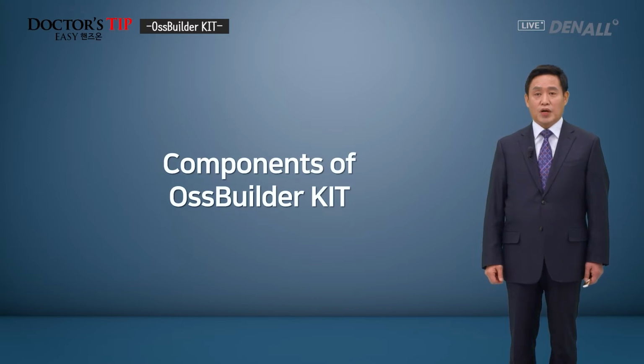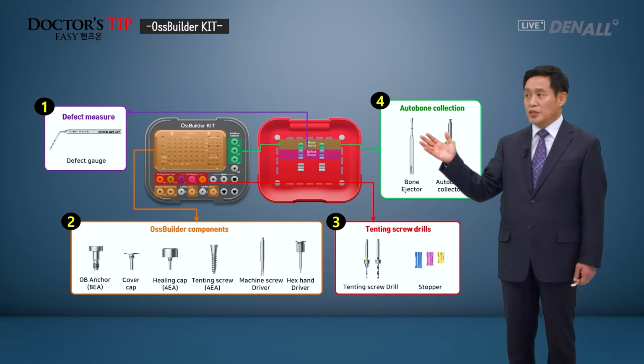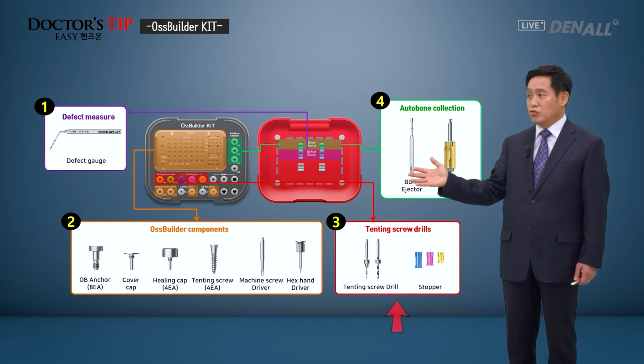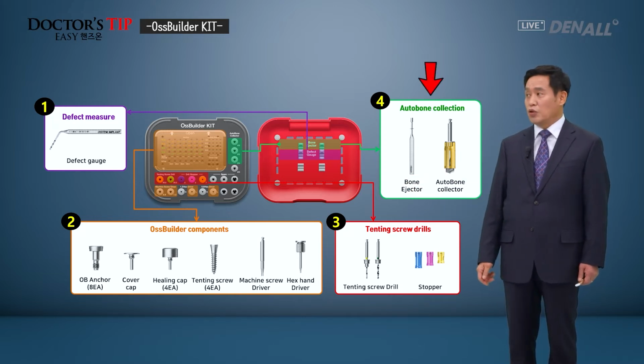Let's look at OssBuilder KIT's components. It is composed of 4 items. First, on the recipient site, you need to measure, and this is the gauge for that. Second is OssBuilder component. These are the components of OssBuilder, and for installation, you need anchor cap and healing cap, and it's all included here. Third, there are the drills for tenting screw and driver. Fourth is the auto bone collector for auto bone collection.